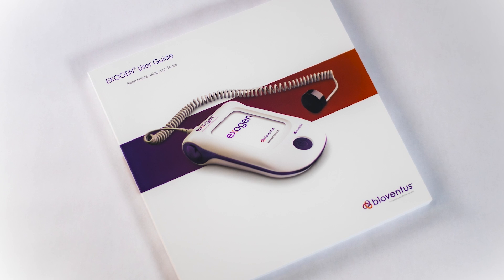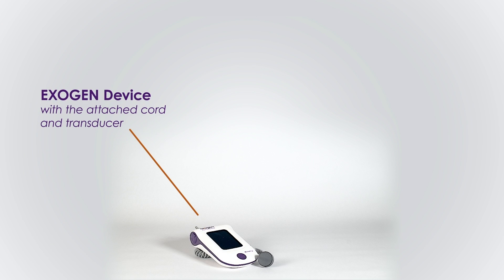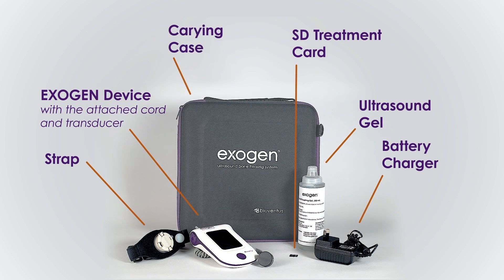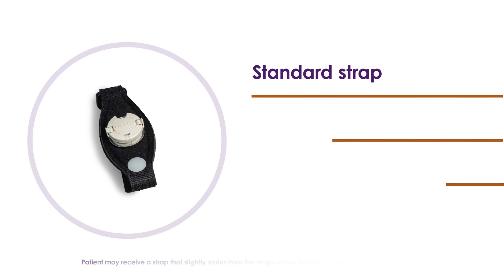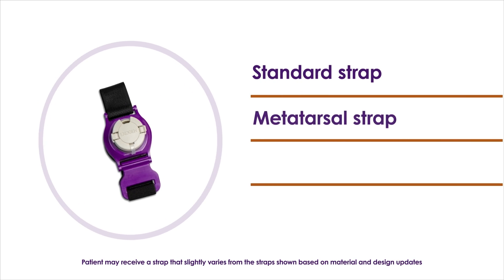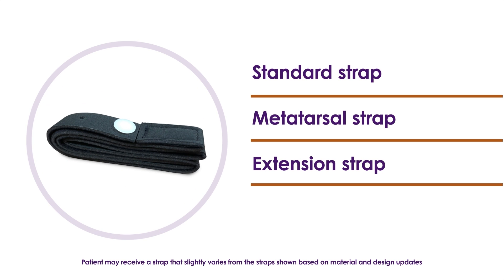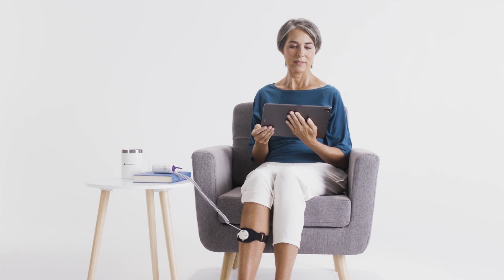The Exogen system includes the device with the attached cord and transducer, as well as a strap, the battery charger, ultrasound gel, SD treatment card, and carrying case. Depending on the location of your fracture, you may have received a standard strap, a metatarsal strap, an extension strap, or a weighted applicator. This video demonstrates use of the standard strap. The other types work in a similar way.